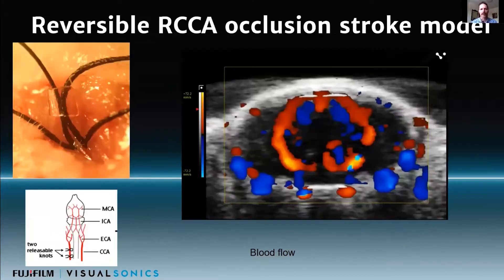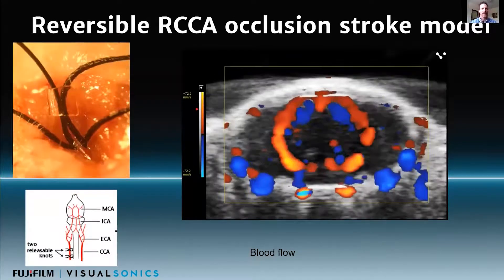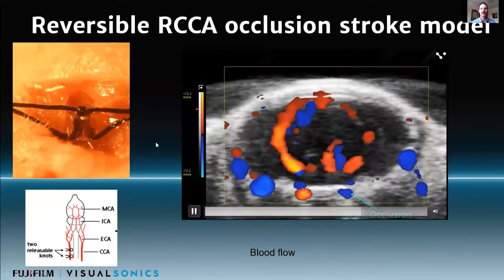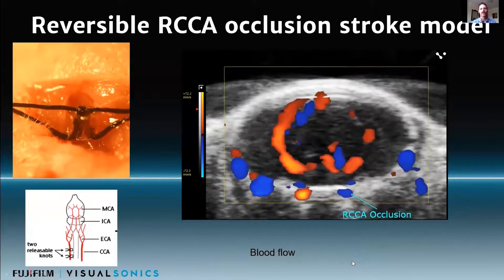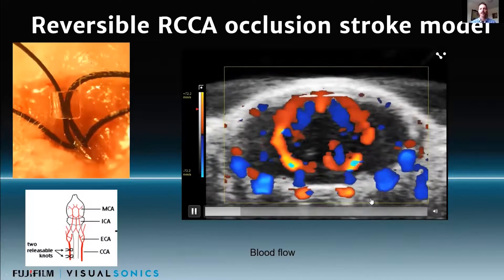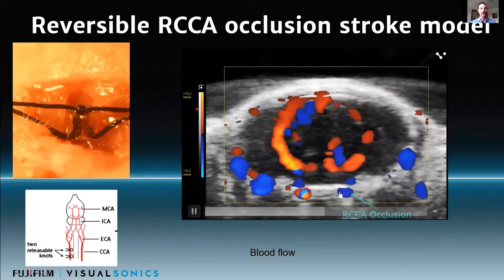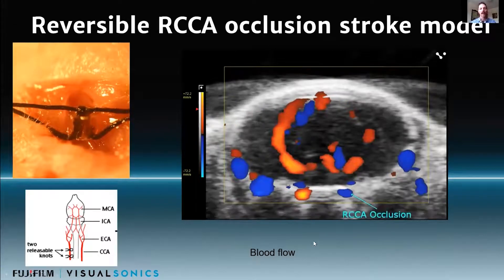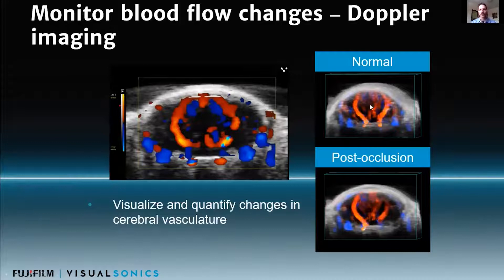Here's a specific example: a reversible right common carotid artery occlusion model to mimic a stroke, where we're actually tying off temporarily the right common carotid in real time. You actually see here a real-time Doppler image of that occlusion — the internal carotid will reverse the flow direction because we're cutting off the right common carotid flow, and you can see the reduction in flow in the right hemisphere. We can do this in 3D and measure the percent vascular as measured by blood flow, so you can measure those changes as well.